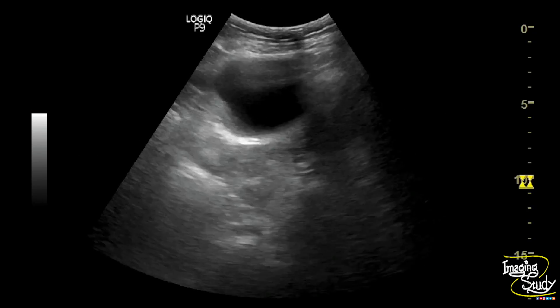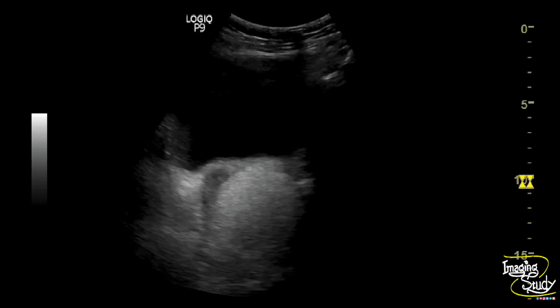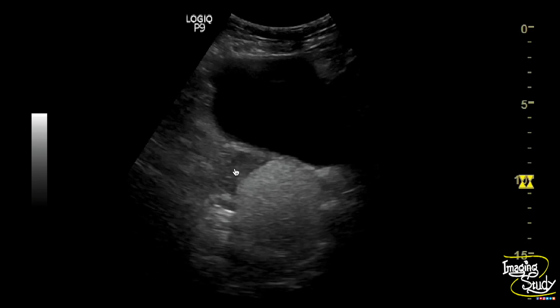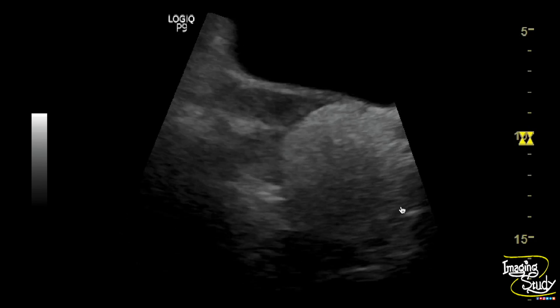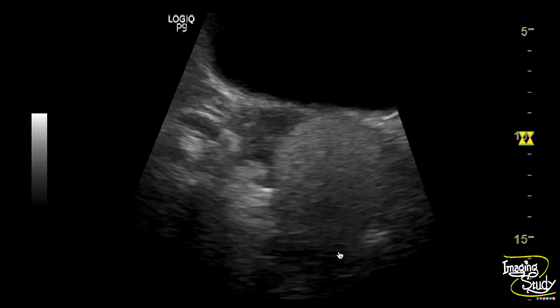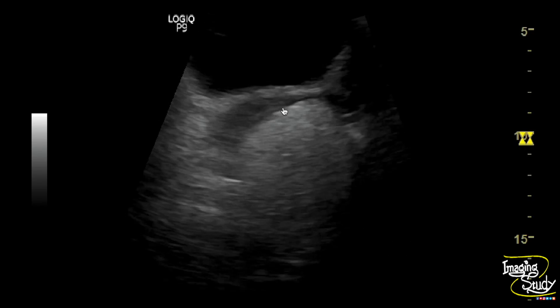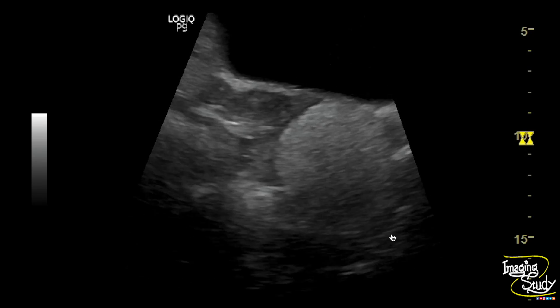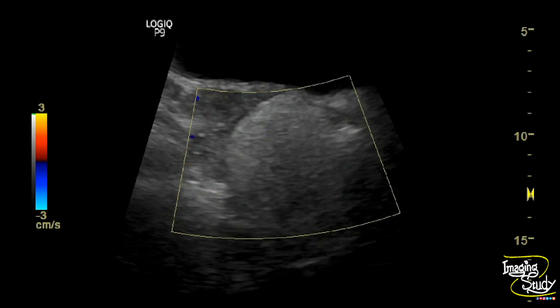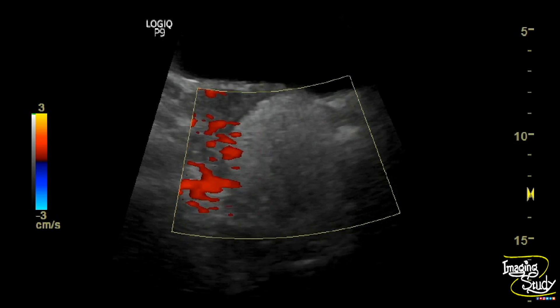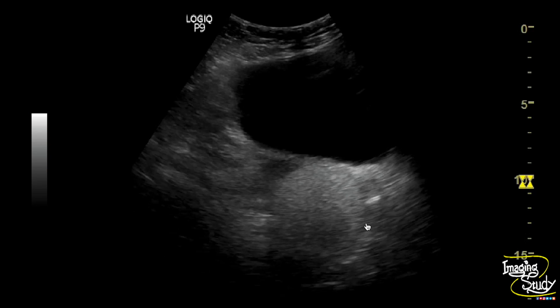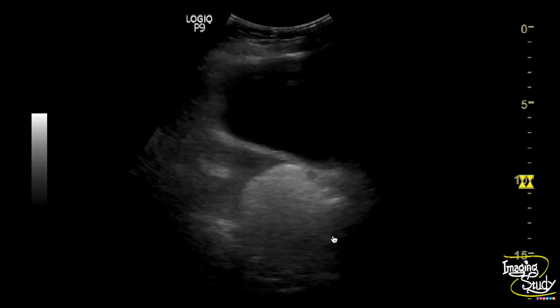Here you can see the transverse section of the pelvic region showing a well-filled urinary bladder. This is the uterus in transverse section, and you can see a well-defined oval to round homogeneous hyperechoic mass at the left adnexal region. Color Doppler shows no definite internal vascularity, and this mass is attenuating the sound.